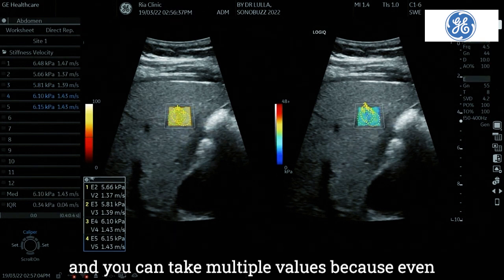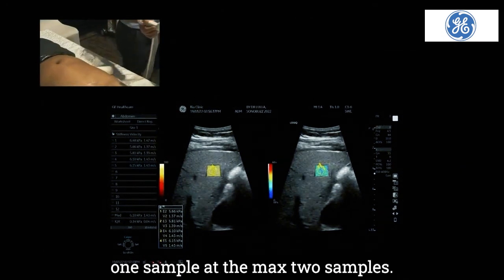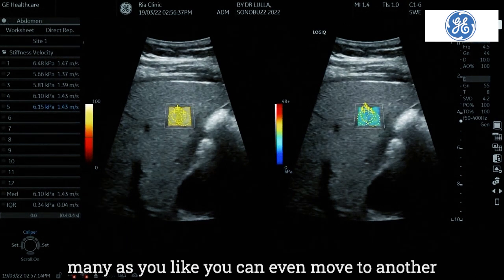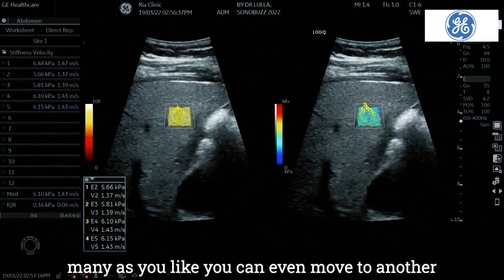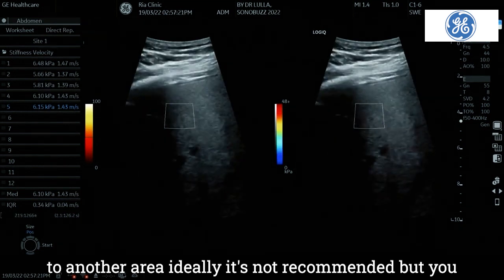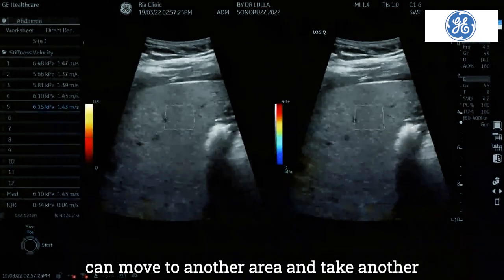And you can take multiple values, because even in a biopsy we take only one sample, or at the max two samples. But with what we call virtual biopsies, you can take as many as you like. You can even move to another area. Ideally it's not recommended, but you can move to another area and take another measurement.